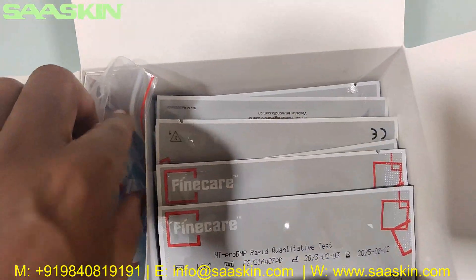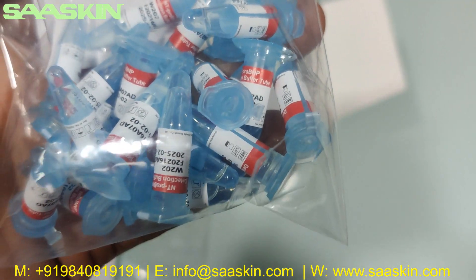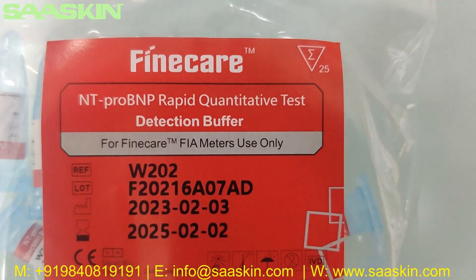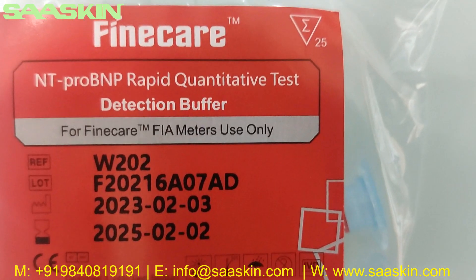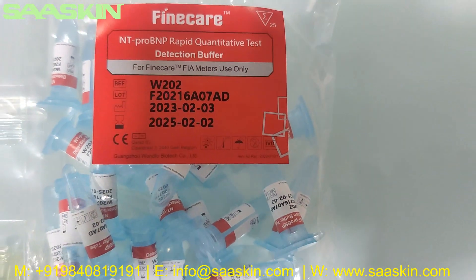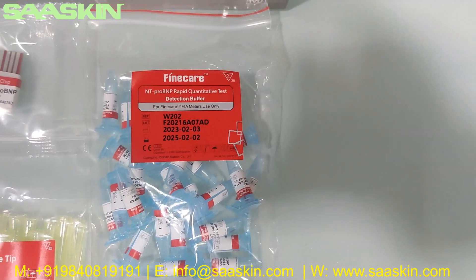Further inside, there are 25 detection buffers. You can see the detection buffers. It says Fine Care NT Pro BNP Rapid Quantitative Test Detection Buffer for Fine Care FIA Meters. You can see the lot number, reference number, period of manufacture, and also the expiry. This is the 25 pack.